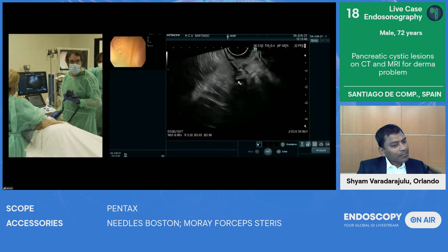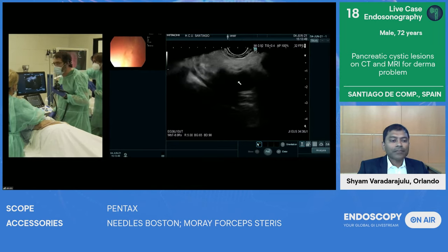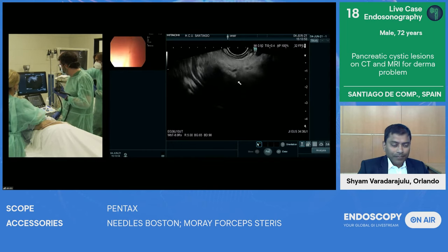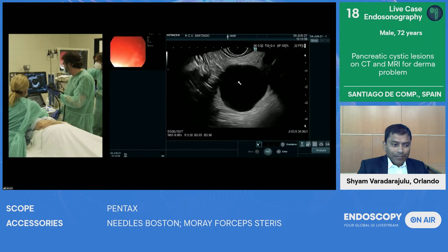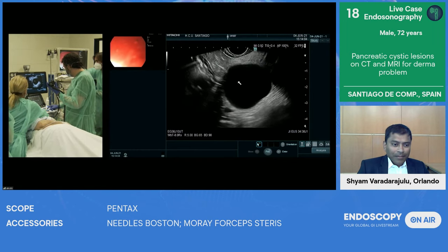I can tell you that in the MRI, there was a suspicion of a strange content that is not appearing in EUS, and we know that EUS is much better to see the content of this cystic lesion, so I'm going to try to see it again. So I have the arrow just in the middle. We have the arrow in the middle of the cystic lesion that is probably the big one. Let's go measure this lesion.